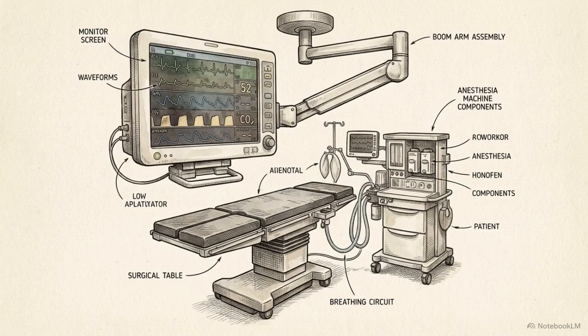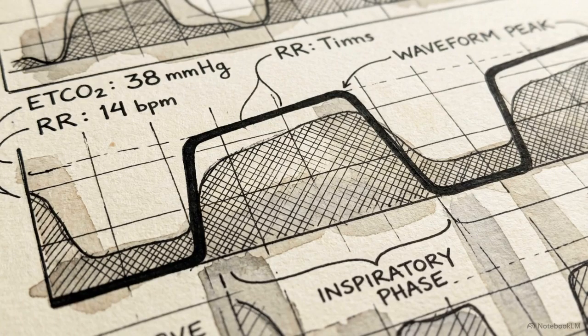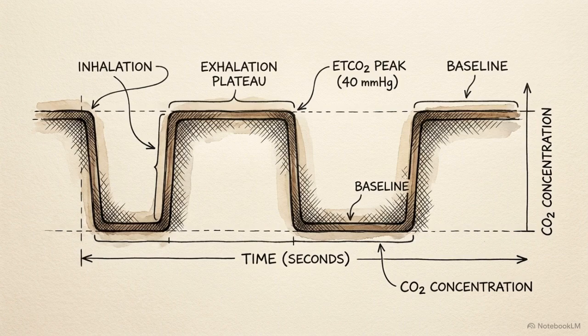Inside a modern operating room, an anesthesia monitor tracks several vital signs simultaneously. While heart rate and oxygen saturation are standard, the carbon dioxide waveform provides the most direct, real-time account of a patient's internal physiological state. This is end-tidal CO2.